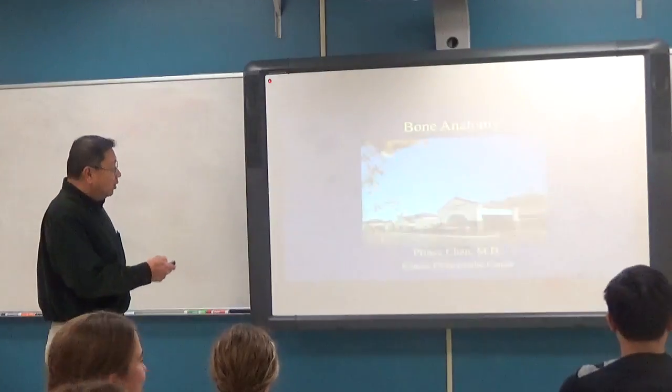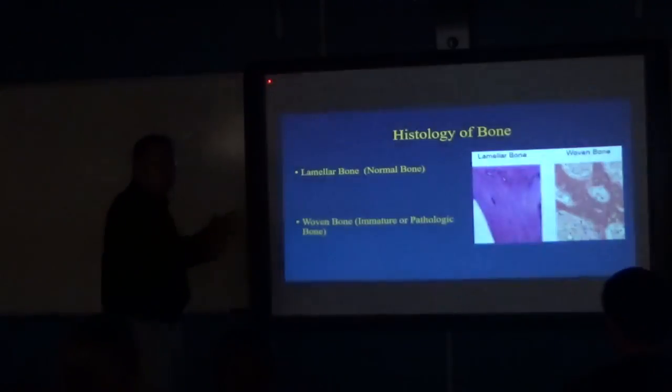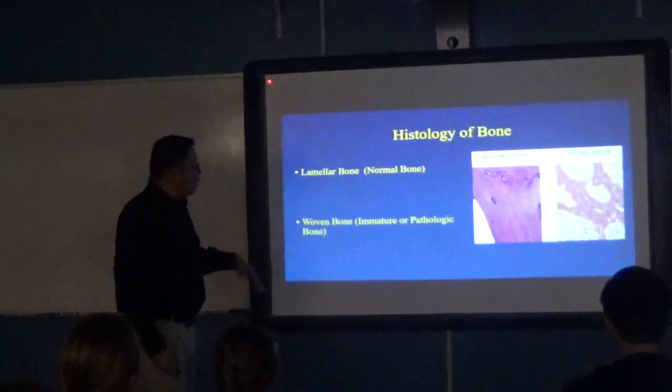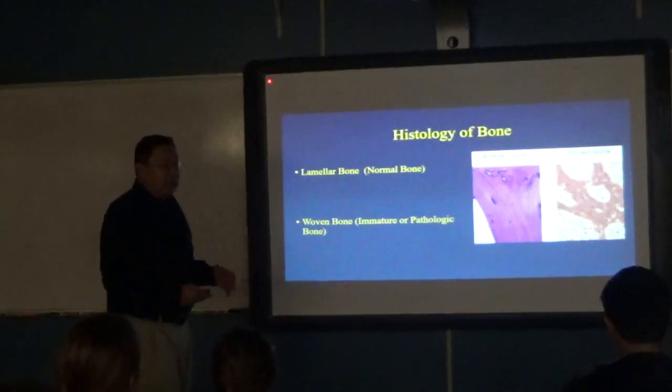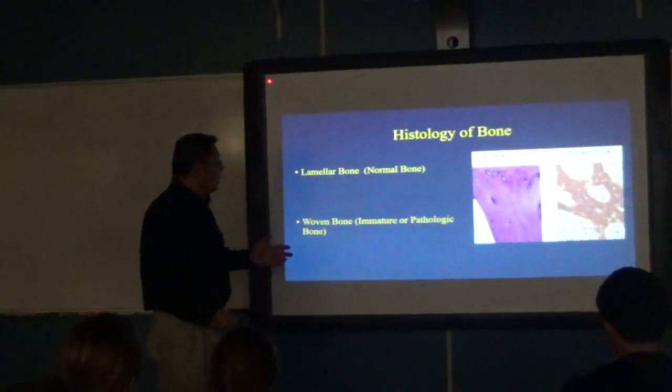Okay. I'm going to briefly talk about histology of bone real quick because Mr. Wire, you guys probably have gone through it already. So I'll briefly talk about this, show you some cases, and if you have any questions in the middle of my talk, feel free to ask.